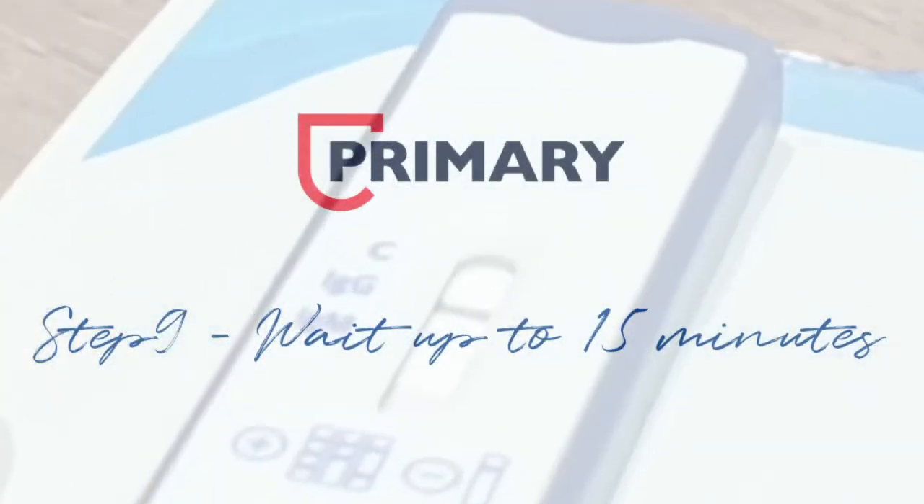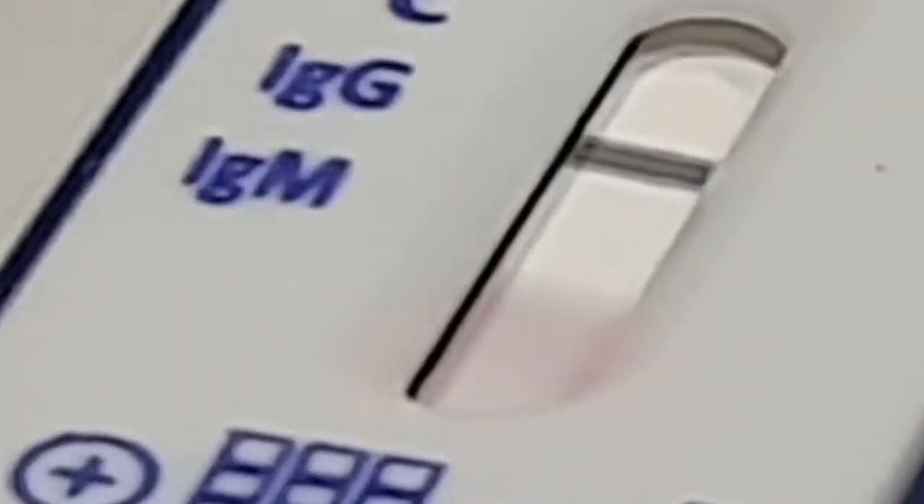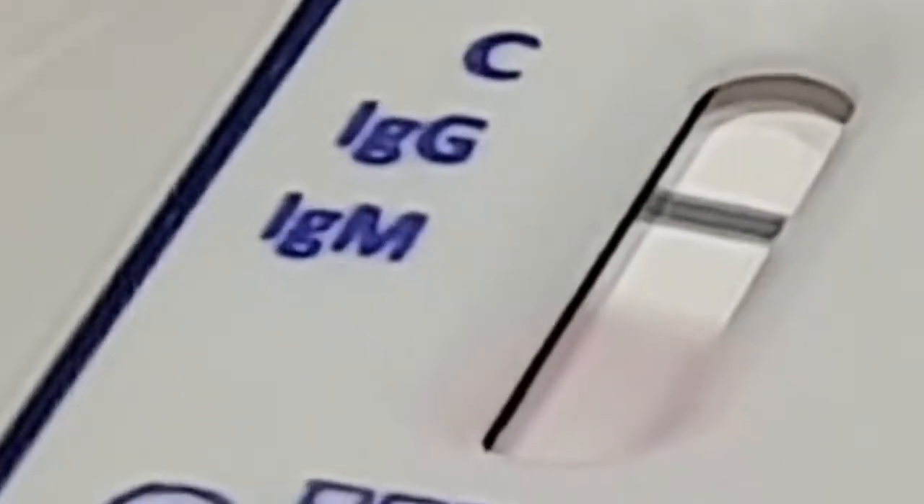Step nine: wait for up to 15 minutes, although results may often be seen much quicker. In the demonstration given using a real sample, we can see that a positive result was obtained in less than four minutes.